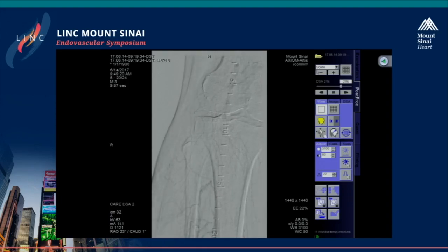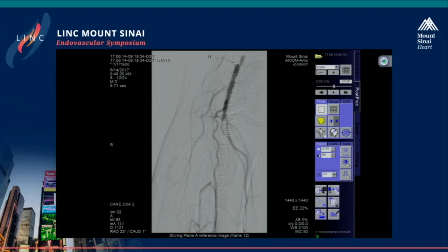So I'm going to have this saved up to the side of me, and I'm just going to use this as my landmark and watch the movements of the wire. And here, Stephen, I'm pretty aggressive, so I will track my catheter in to give me support. I know that a lot of people use microcatheters, but in this situation, I think steerability is going to be important. I'm really hoping that I'm going to get really lucky and just pop right in.